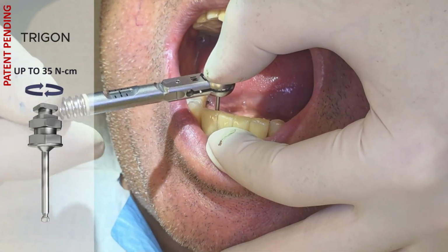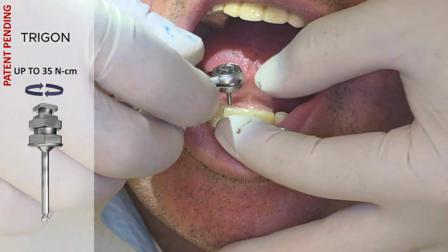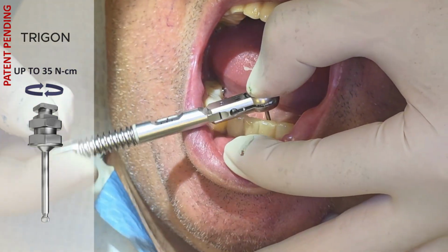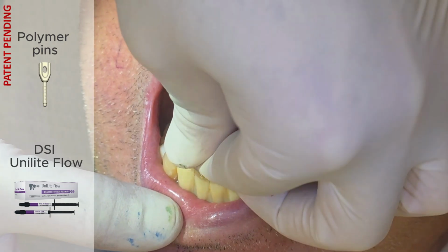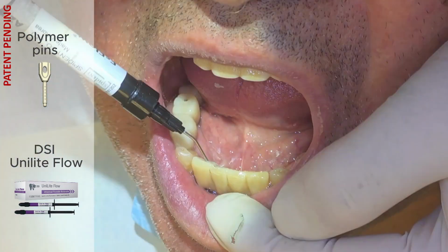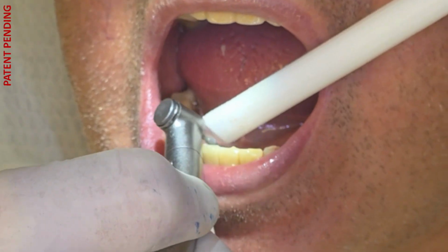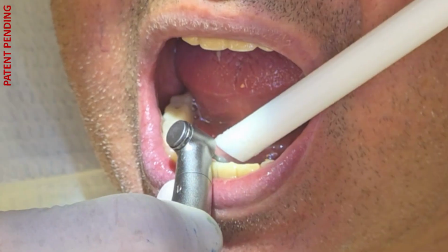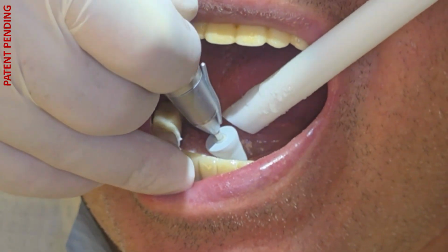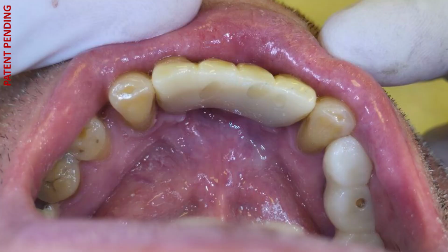Now the restoration can be definitively fixed. The trigon screwdriver is used, providing torque of up to 35 Newton-centimeters. We then seal the access channels with polymer pins, apply flowable composite, and thoroughly polymerize. Excess material is carefully removed. Final polishing is done with a gray rubber wheel. Its large diameter provides a very smooth and even surface. The work is complete.